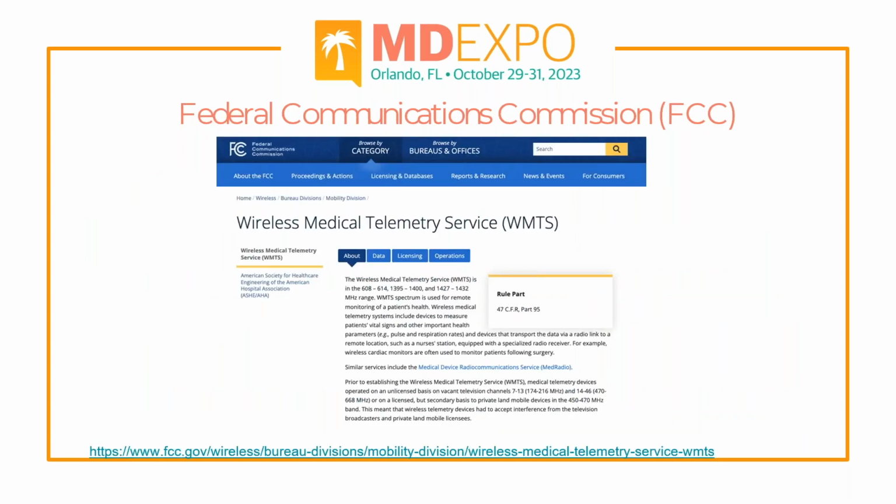All right, so we talked about the FCC, the Federal Communications Commission, which regulates wireless communication. So this is way back. They came up with this thing called the WMTS, which is the Wireless Medical Telemetry Service. And they specified these bands. I'm sorry, I have to go close here to read this. These are the frequency ranges: 608 to 614, 1395 to 1400, 1427 to 1432 megahertz. And these are used for remote monitoring in your hospital.